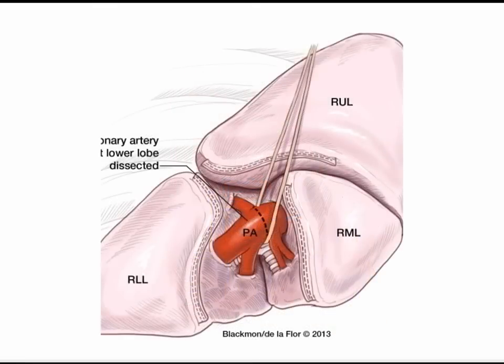Sometimes it is impossible to dissect the right lower lobe bronchus without risking injury to the pulmonary artery. In cases where there is too much scar tissue, an adherent lymph node, or where you would like proximal control of the pulmonary artery, we recommend going into the fissure and dissecting out the pulmonary artery. By identifying the major fissure separating the right lower lobe from the right upper and middle lobes, you can see the basilar branches. Those basilar branches are easily dissected, encircled, stapled, and divided — a safe approach to ensure you do not narrow or limit blood supply to the right middle lobe.